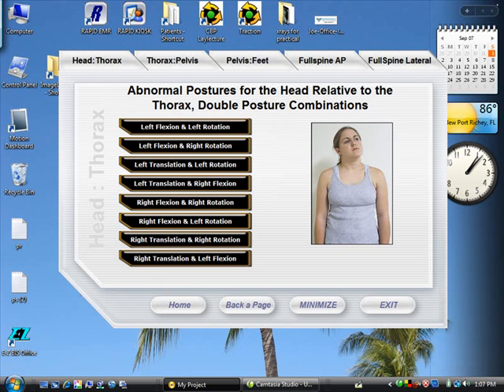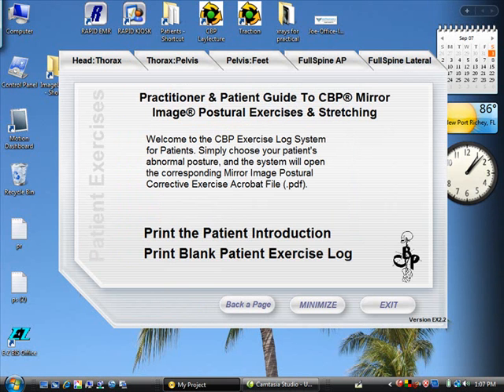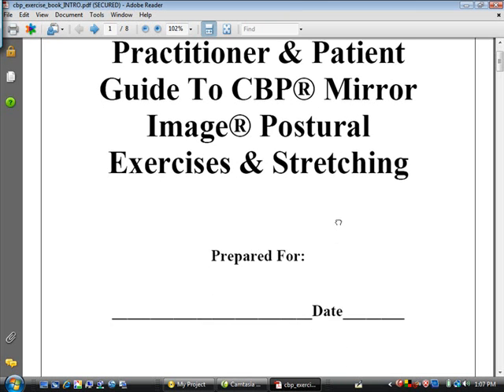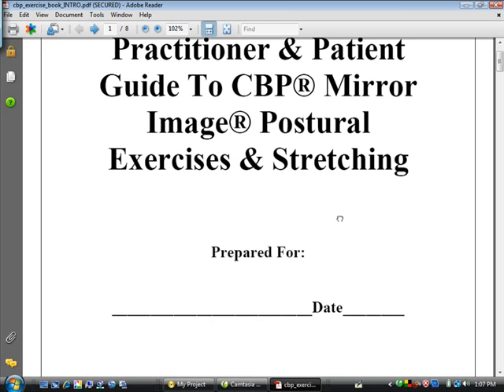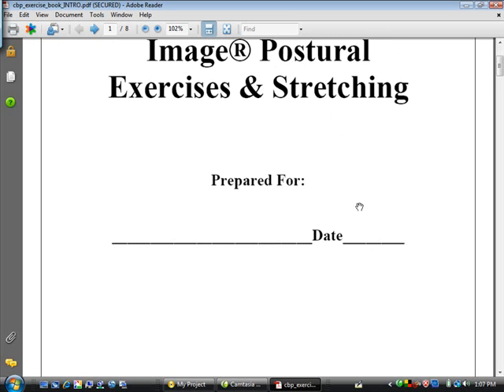You can just prescribe the exercises, but if you want to give your patient a little bit more introduction and you're not using the PosturePrint, what we suggest you do is print the patient introduction right here. The patient introduction is a booklet that you can print on demand — it's eight pages long. You'll print their information here: their name and the date that you prescribe it.